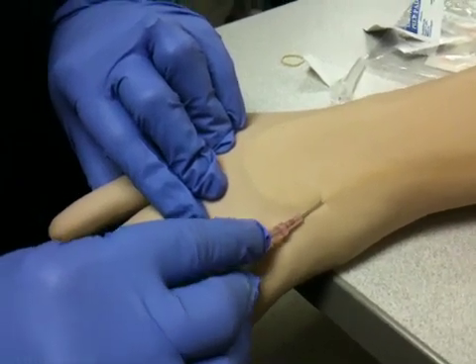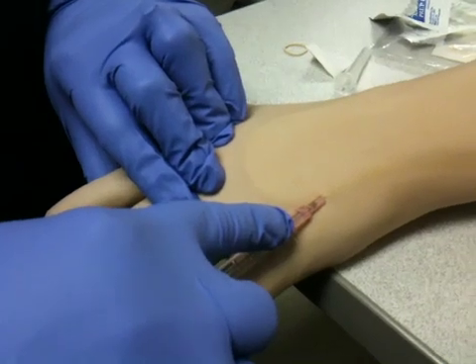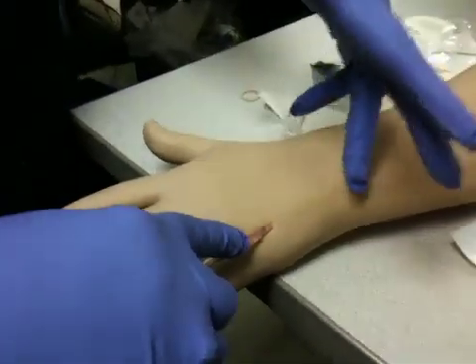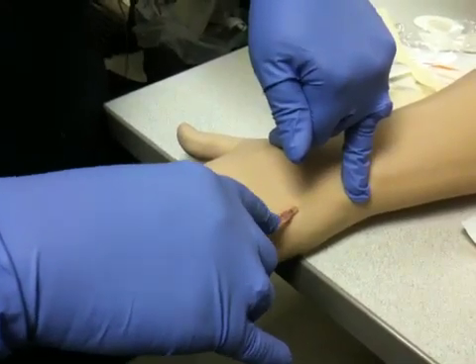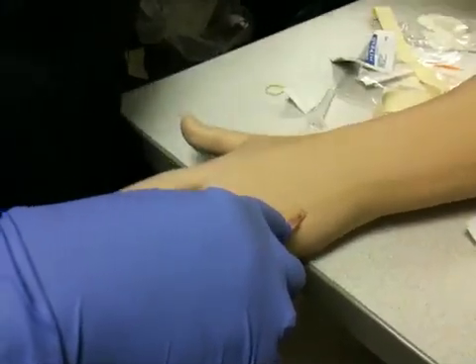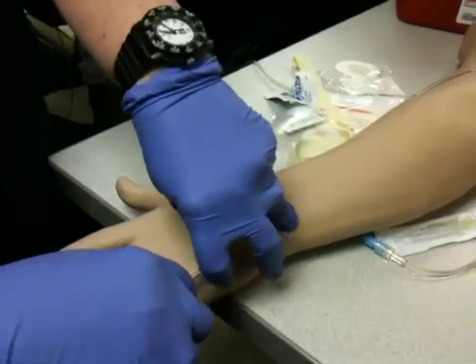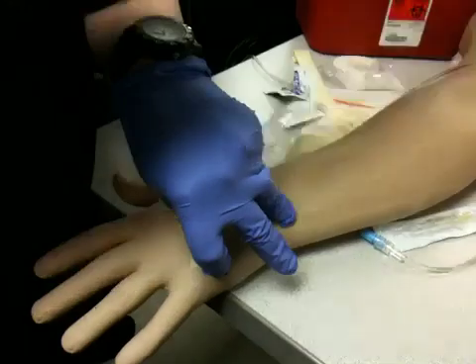Go just a little bit further. I'm threading the catheter off of the needle. Now, notice how I'm going to take my ring finger and I'm going to tamponade off that vein. If I don't, when I pull this needle out, it's going to just start pouring blood. So I want to make sure that I have my line ready. Notice I still haven't taken the end off of it. Tamponade it off, and the needle goes directly into the sharps container.